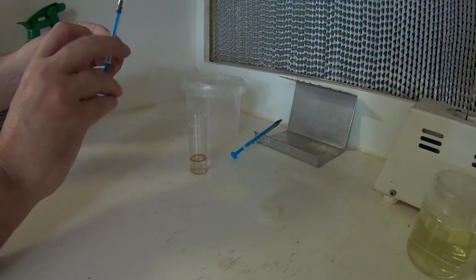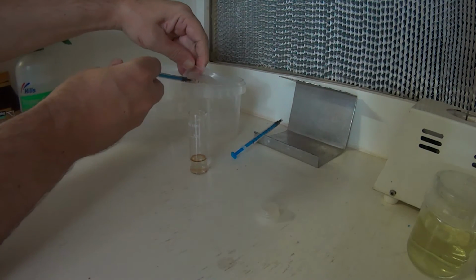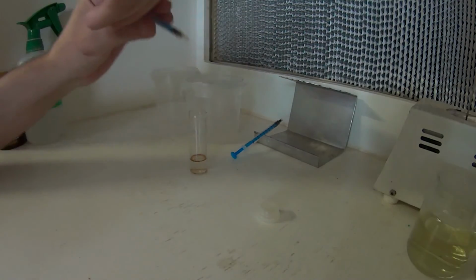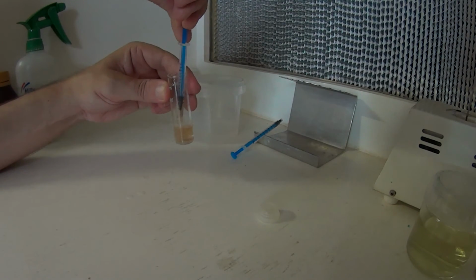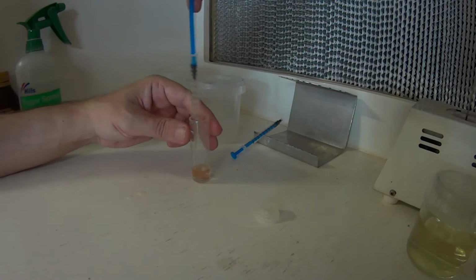And we'll just squirt that top bit into the container again, like thus, and give it one more go into that container, and obviously agitate it, otherwise you're soaking up straight hydrogen peroxide. There we go.